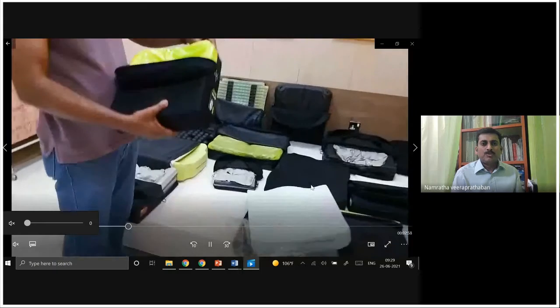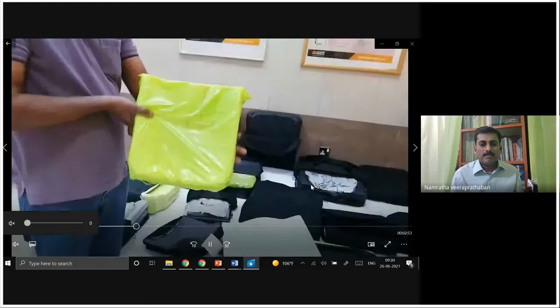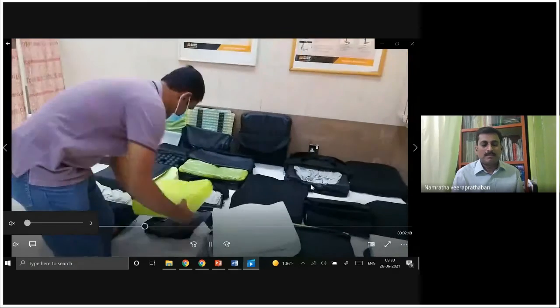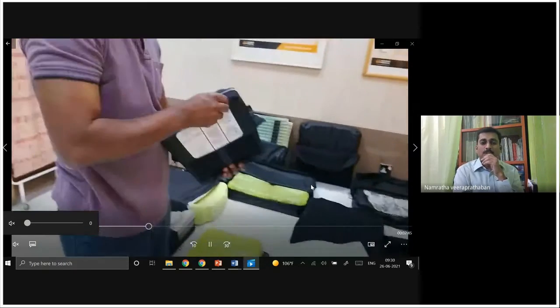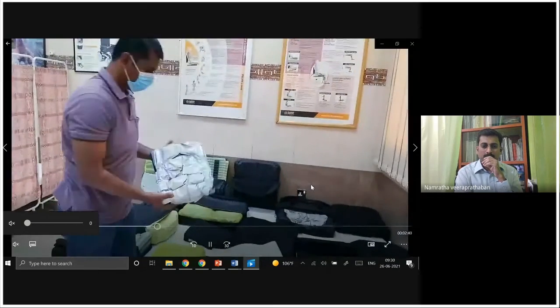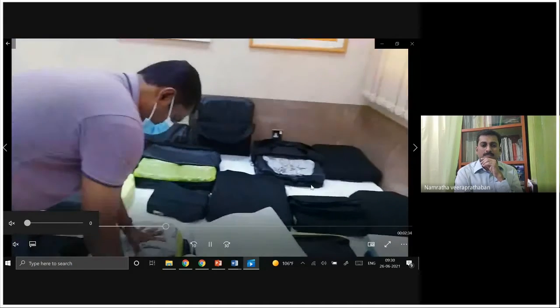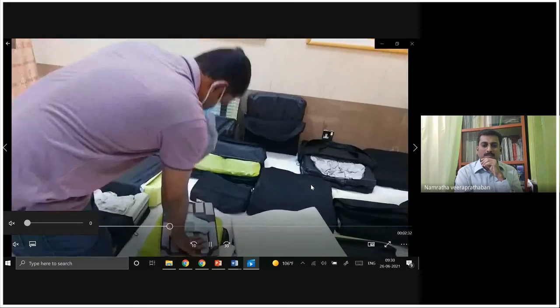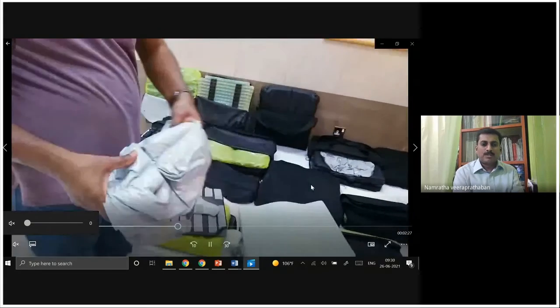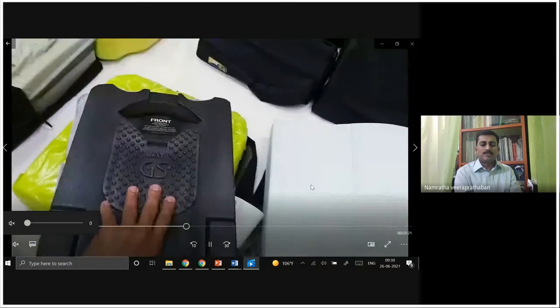Now I'm sharing the pediatric memory foam cushion for children. Again, it is beautifully contoured. Now this is a gel cushion. This is a solid base, and you can remove the gel pad. This is one of the cushions for children who have skin integrity issues.